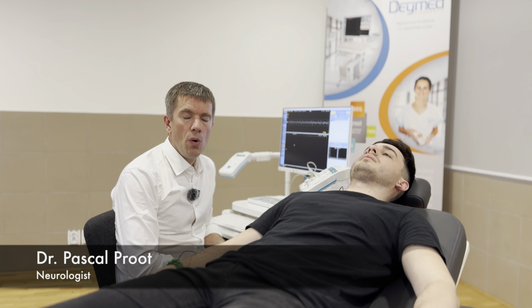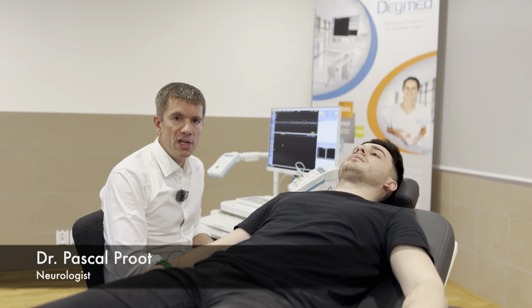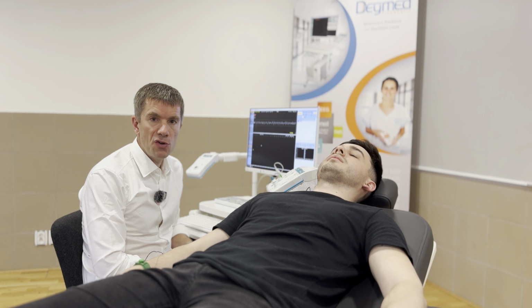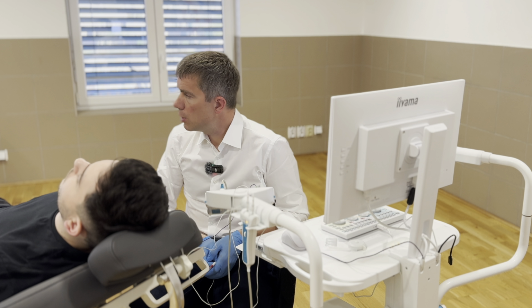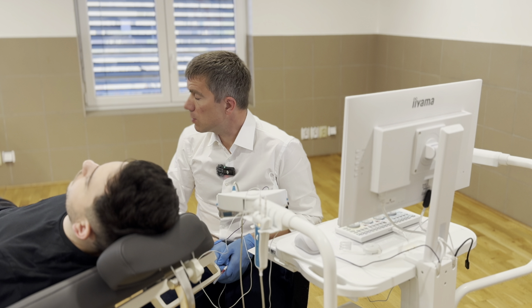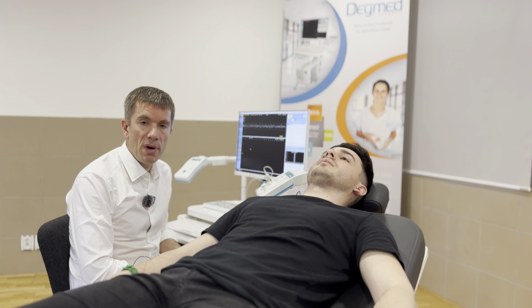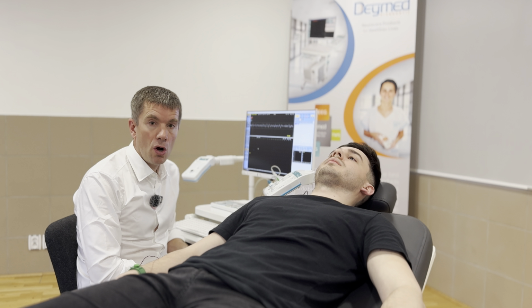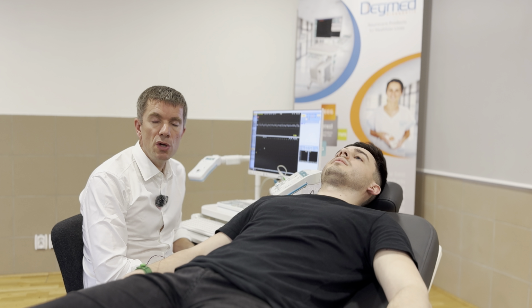In this video, we show the stimulated single-fiber EMG of the orbicularis oculi, a test that is done regularly in cases suspected of ocular myasthenia gravis or generalized myasthenia gravis or other neuromuscular junction disorders.